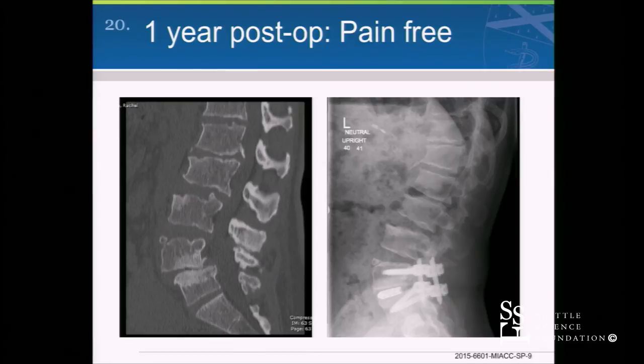Yep. How does it look on post-op MRI and CT? How do you assess fusion? Right. So the Globus cage, that is a hybrid PEEK metal, there really isn't much artifact on the MRI, especially at the adjacent segments. Sometimes you put these things in there and it blossoms and you can't see the adjacent segments, but that's not the case here. Actually with this, I haven't had an issue with adjacent segments. There is a little bit more blossoming at the index segment, because it's metal, but it's not stainless steel, it's titanium. So the artifact isn't horrible.